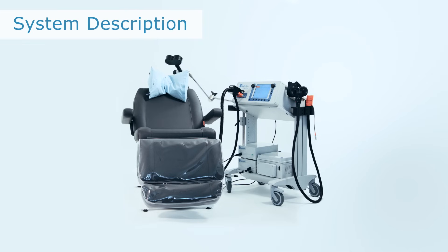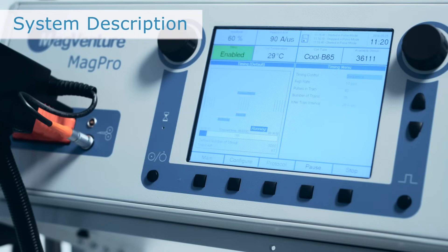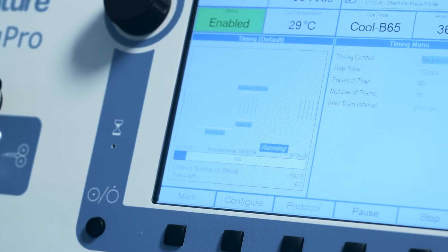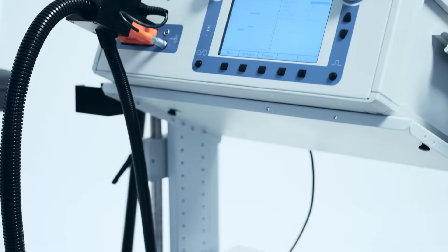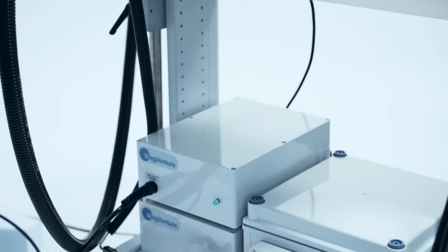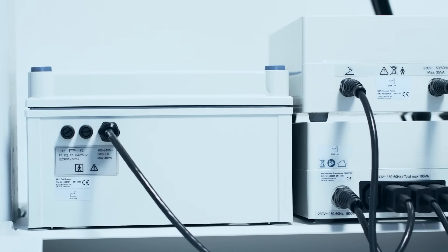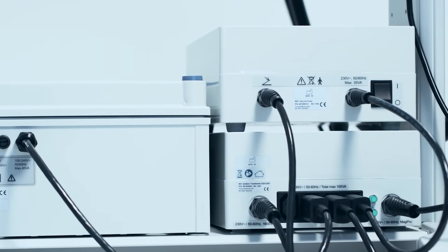The MagVida TMS therapy system consists of a magnetic stimulator type R30 or X100. The stimulator is an all-in-one stand-alone solution with a built-in display for easy user interface. The stimulator is mounted on a trolley along with the system's isolation transformer, vacuum pump, and cooler unit. The isolation transformer provides power for all components in the system including the stimulator, chair, cooler, and pump.